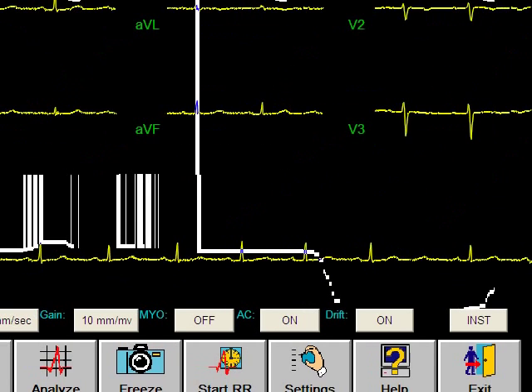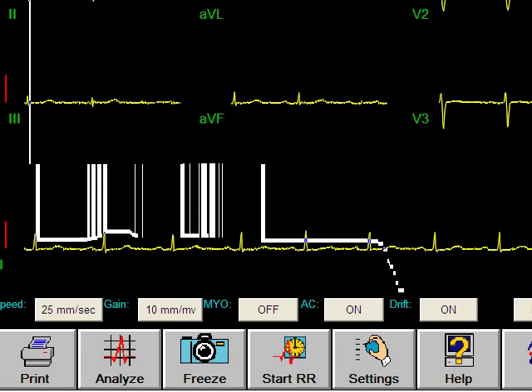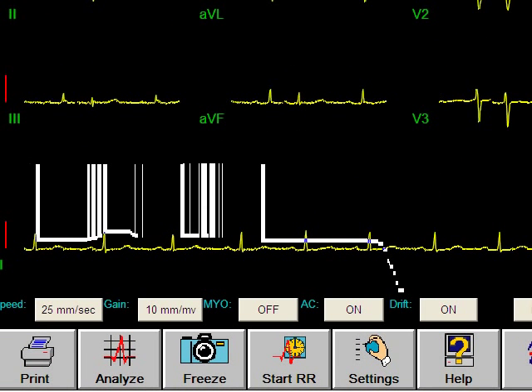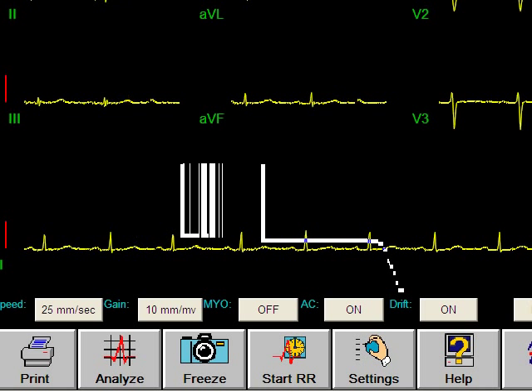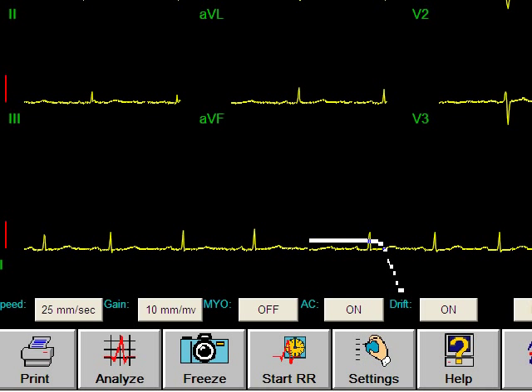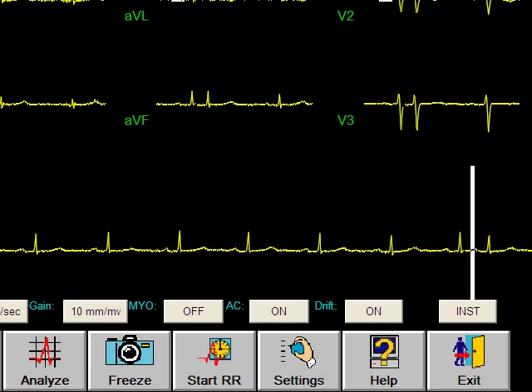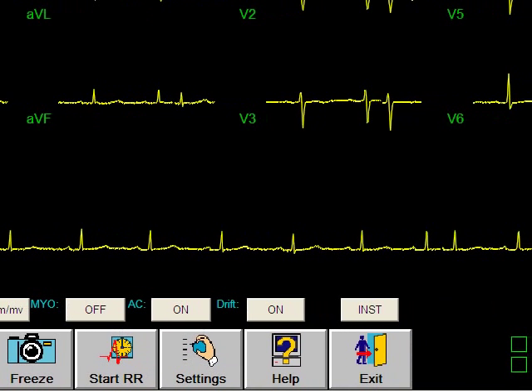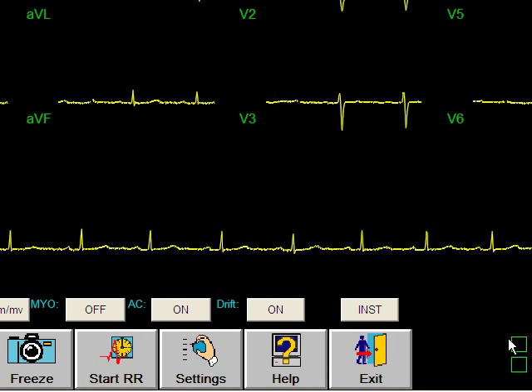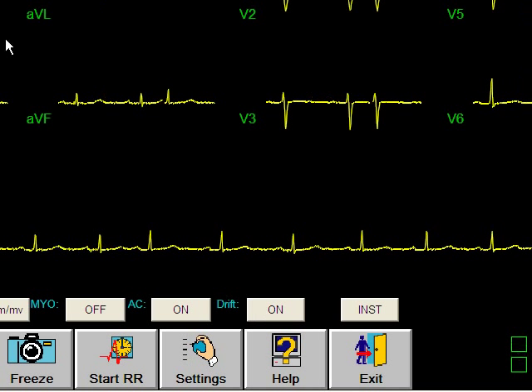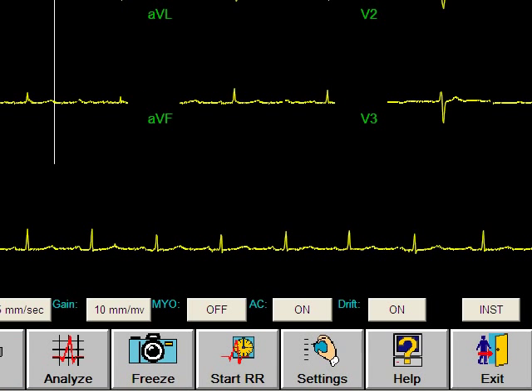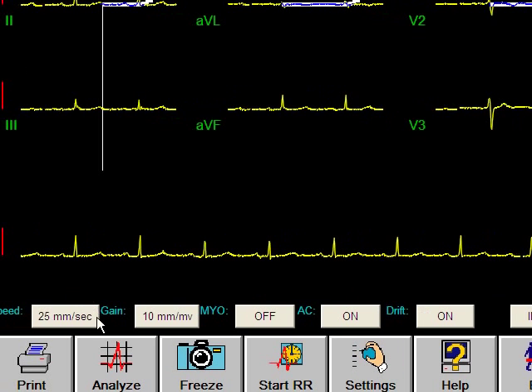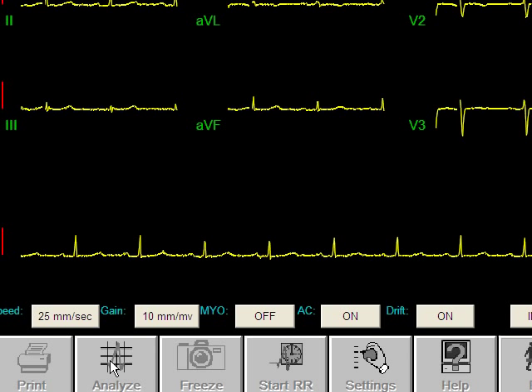We see all of the leads and all of the optional buttons at the bottom. Once you've determined that the EKG looks good, there's no noise on it, you've got good quality, you can click Analyze. Let's go back over there to Analyze and we'll click the Analyze button right there.